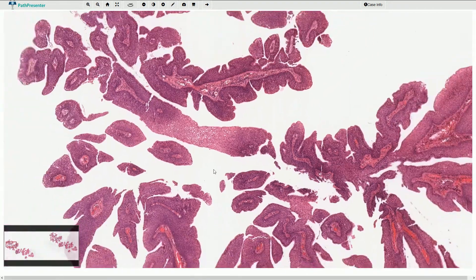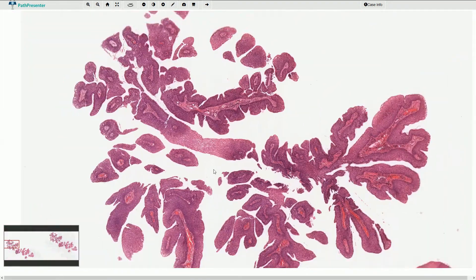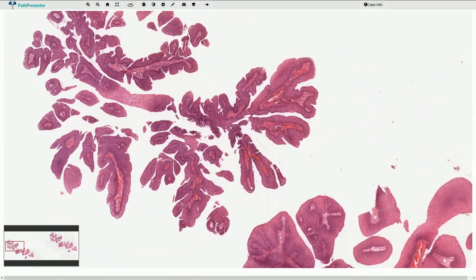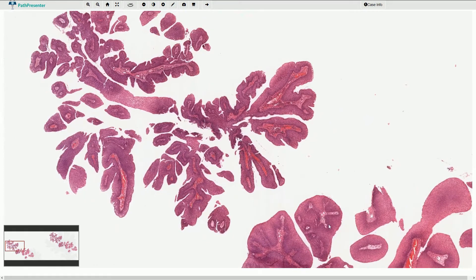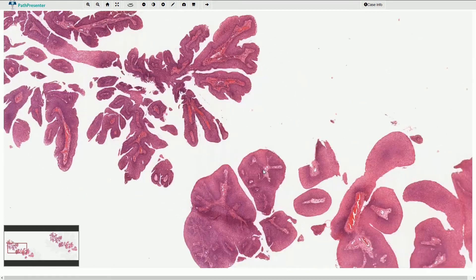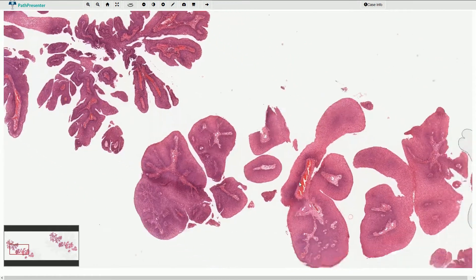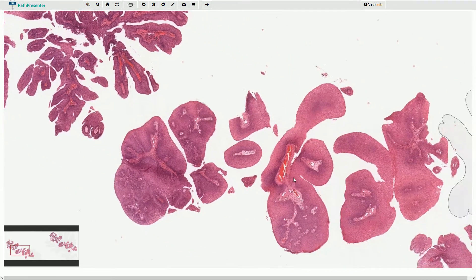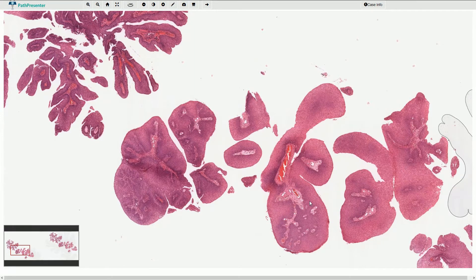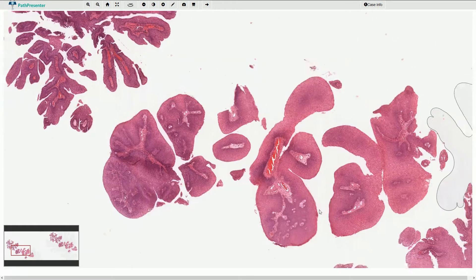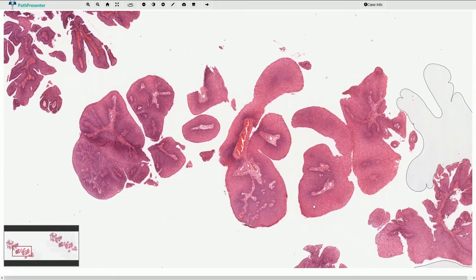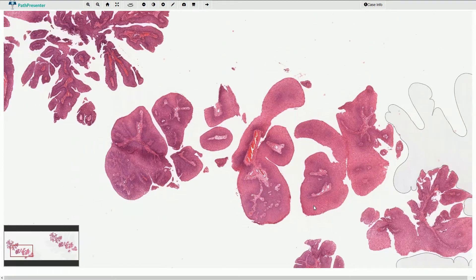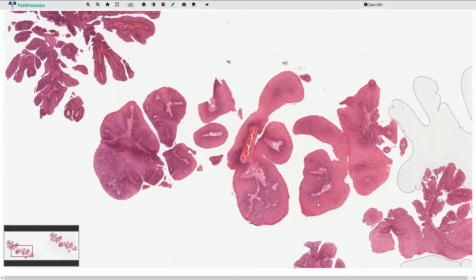This is squamous papilloma associated with HPV low-risk infection. Usually types 6 and 11 are responsible for the development of squamous papilloma in the larynx.